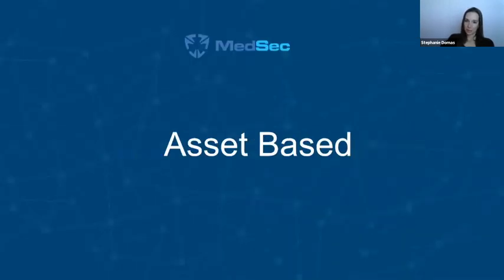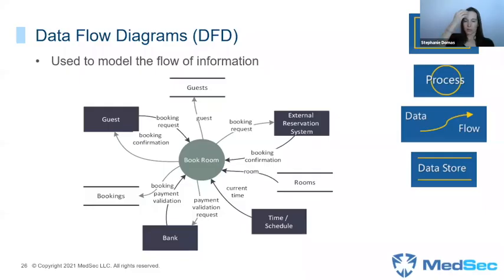So threat modeling methods. So I mentioned the asset-based first. We'll go through a couple here. And I also mentioned before, there is never an end to the number of methodologies out there. I'm going to introduce to you what I feel are the two best asset-based models. And by best, I mean the ones that I have seen really drive impact to medical devices successfully. And so there are other methodologies out there. If you use one that's not one of these, that's completely okay, as long as it's driving value for your design process. So the first one is starting with something called a data flow diagram.